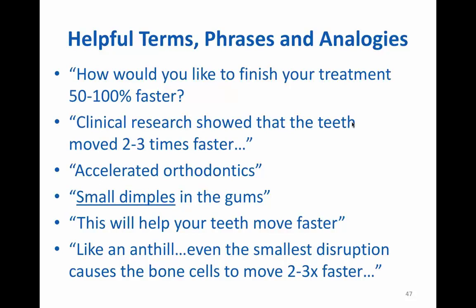And then my favorite quote, if you've been to my 6-month smiles course, where I'm an instructor, one of the things that I say throughout the course regarding things like interproximal reduction and bite guards, and in this case Propel, is this will help your teeth move faster. And it always helps to calm patients down if they get a little bit anxious about things like bite guards, interproximal reduction, and in this case, micro-osteoperforations. And I already mentioned the anthill analogy. It's a very effective way to illustrate how these teeth will move faster.